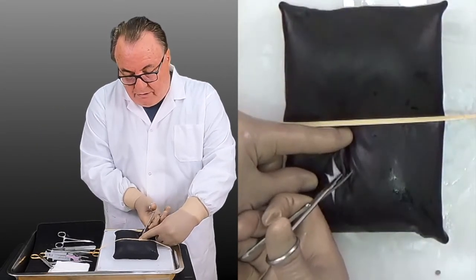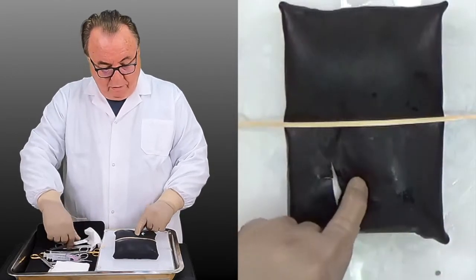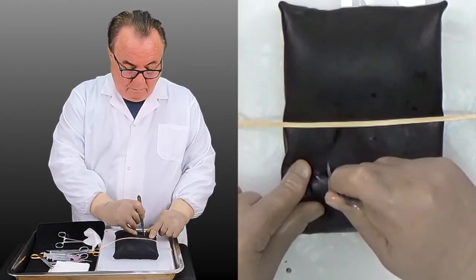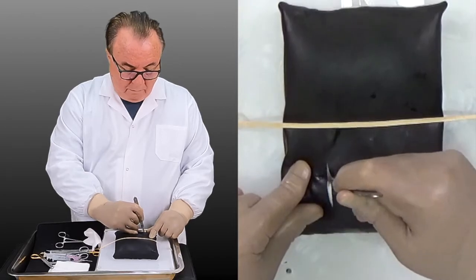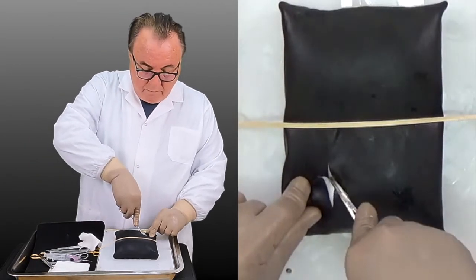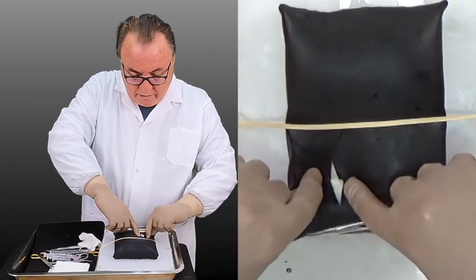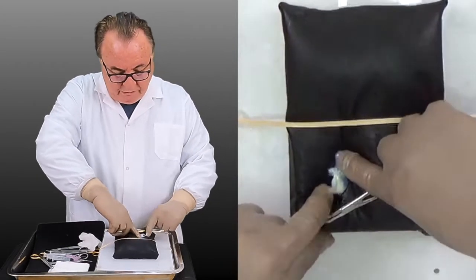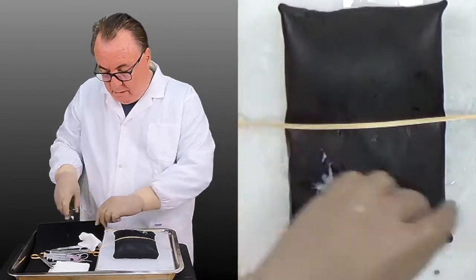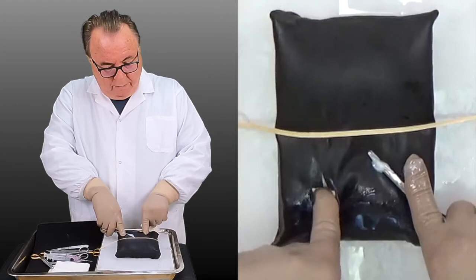We have a cross incision. We can use a number 11 blade to find the abscess. We can see we found the abscess and we're getting the pus to come out. We put our finger in to make sure that we get all of the abscess drained.